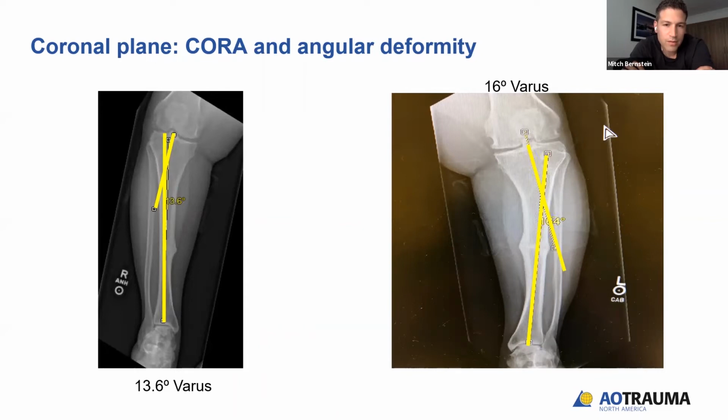I'd also like to calculate the apex using an MPTA in the proximal segment instead of an anatomic axis line, just so that you can do the same in the femur, and then that'll help you get your mechanical axis at the end of everything neutral or medial. You can mathematically determine that, or at least put it into Raul's Bonesetter app or any other virtual software to play with the cut.